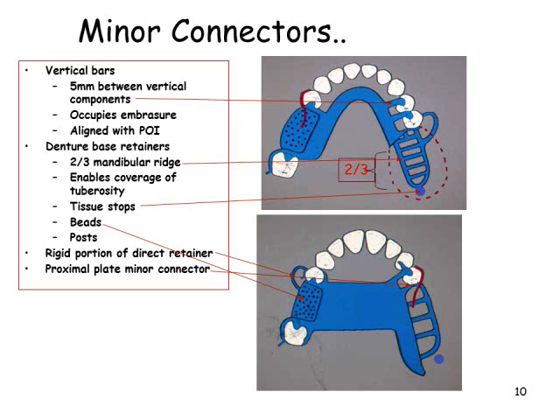Denture base retainers are minor connectors. This minor connector should be so constructed that it will be completely embedded within the denture base. The junctions of these mandibular minor connectors with the major connectors should be a strong joint but without appreciable bulk. Angles formed at the junction of the connectors should not be greater than 90 degrees. An open latticework or ladder type of construction is preferable in the extension base partial denture.